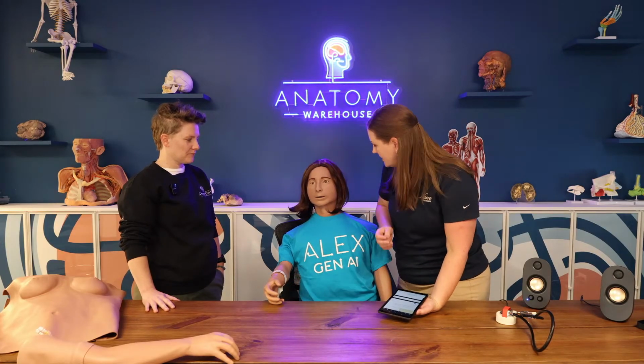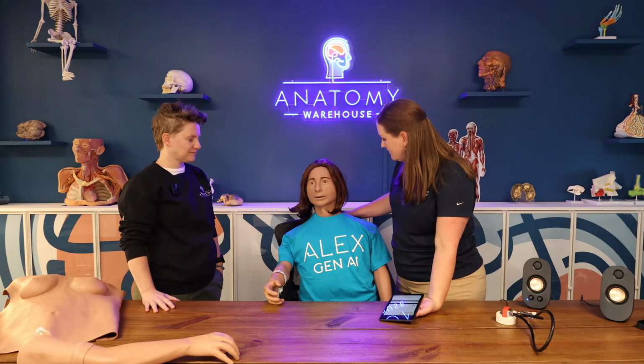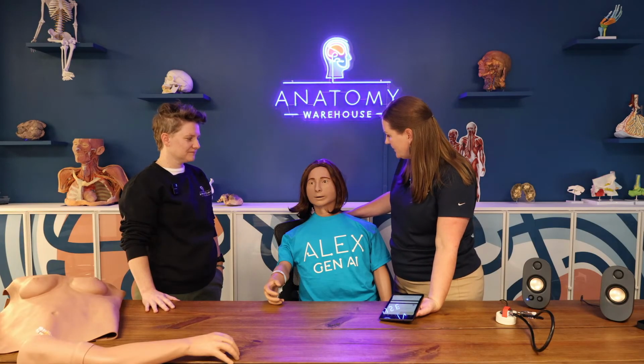Okay, and where are you coming from? I've been living in Crest Hill. All right. And you've recently moved here? Yes, I moved here about a year ago. And how is your health overall? Are you feeling pretty good?